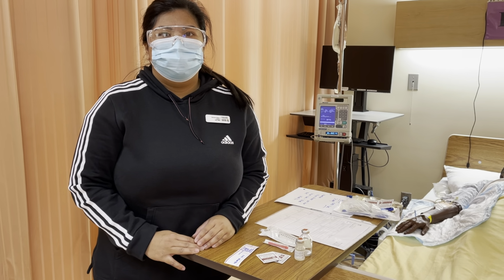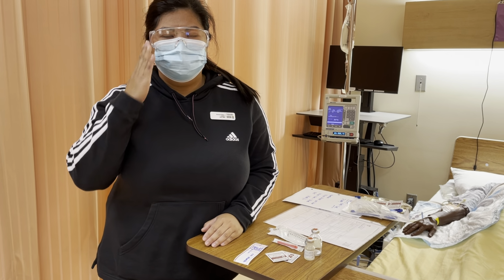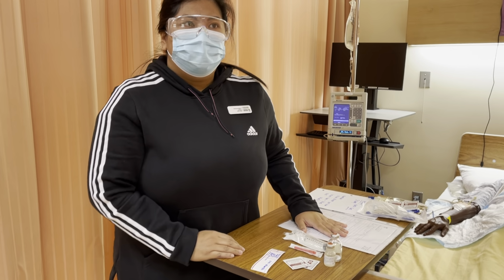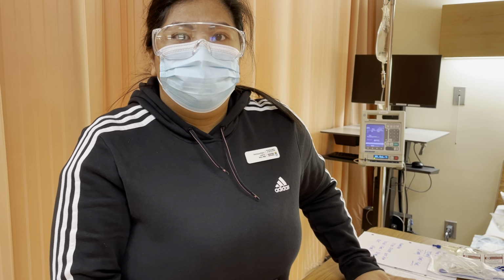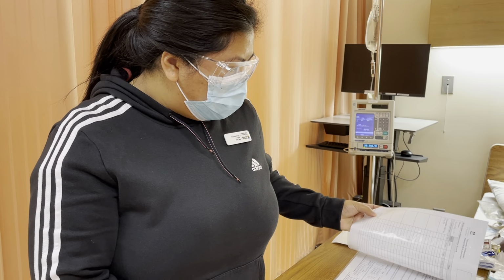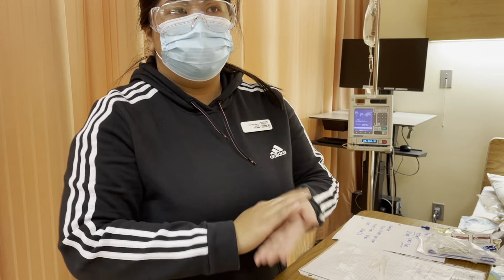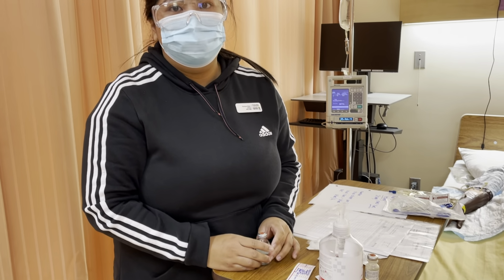In this video, I'll be demonstrating how to administer IV medication via IV intermittent. So the first thing that I'll do is review my order and review my patient's chart. I'm looking for the diagnosis, if the medication is appropriate for them, and if the patient has any allergies. After that, I will do hand hygiene and then gather my medication, and then do my first medication check.